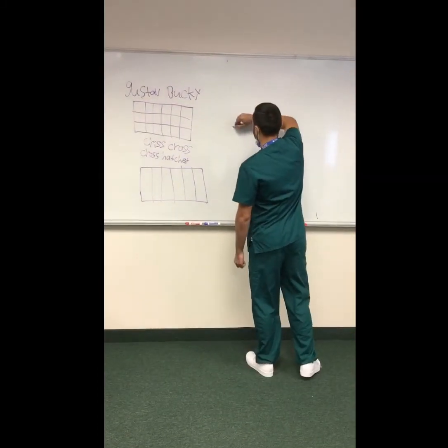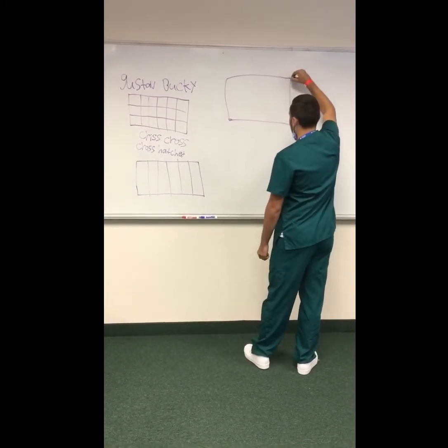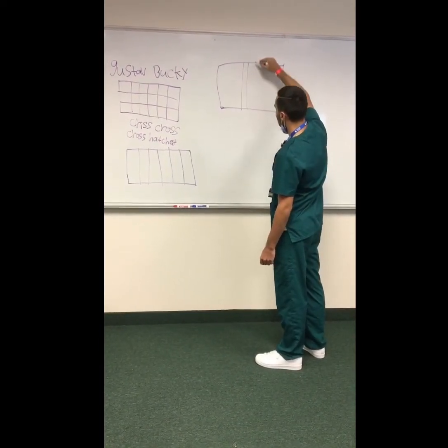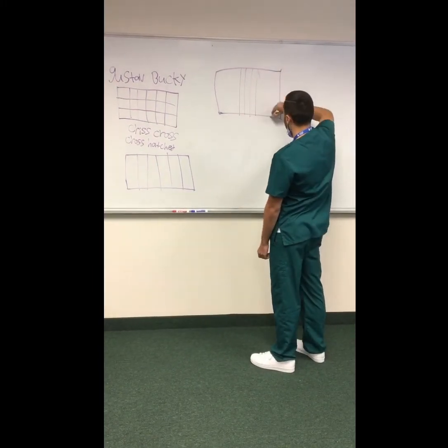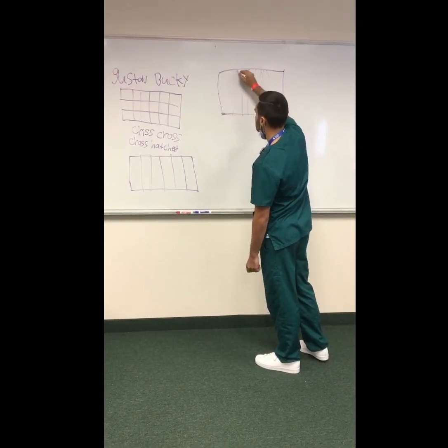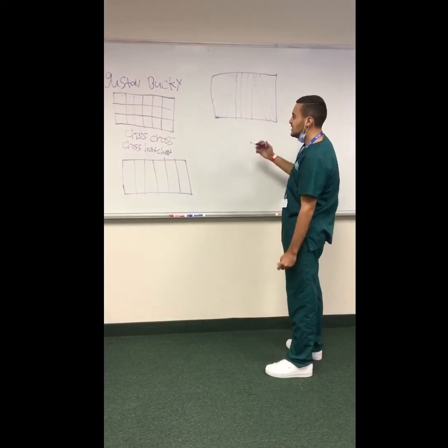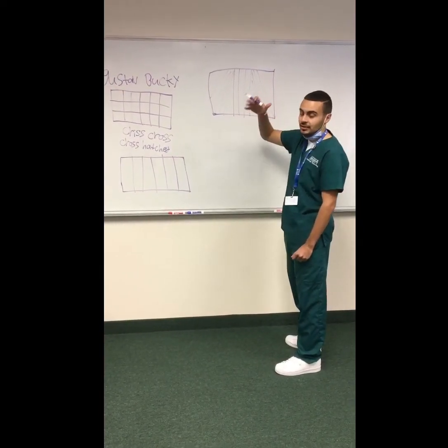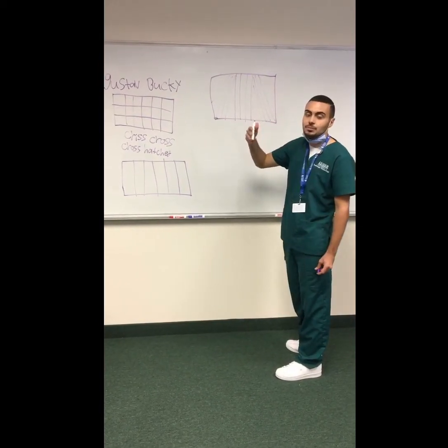The grid that's perfect to take X-rays is called a focused grid. It's going to look like this. In the middle of the focused grid, we're going to have the parallel lead strips, but from the middle out, they're all going to be slanted. Now this grid is actually going to be perfect to take X-rays because the beam exits the X-ray tube in a slanted or angled manner, it's going to coincide perfectly with this grid, and you're going to have an overall better image.